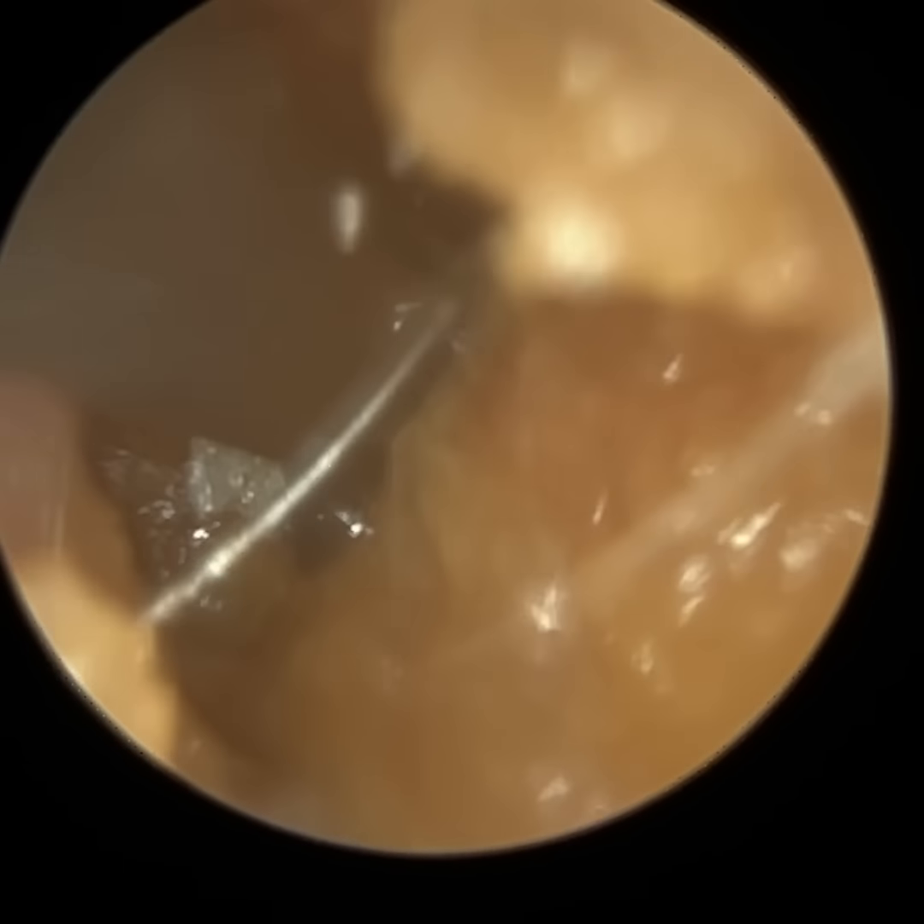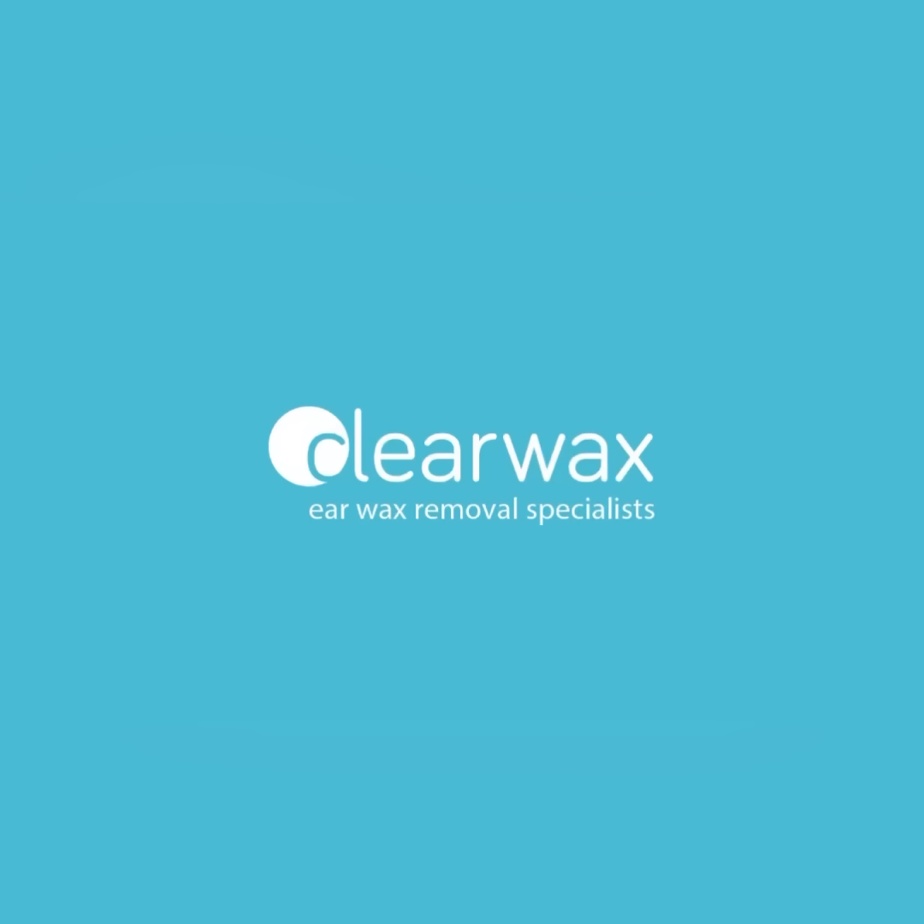In this left ear, you can see how narrow the ear canal is. I began using the right angle curette, but the wax is a bit softer and the ear is a bit narrow, so I reverted back to microsuction. In comparison to the right ear, this eardrum isn't retracted, although it's quite vascular — you can see all the manubrium arteries which supply blood to the hammer bone, slightly vascular.